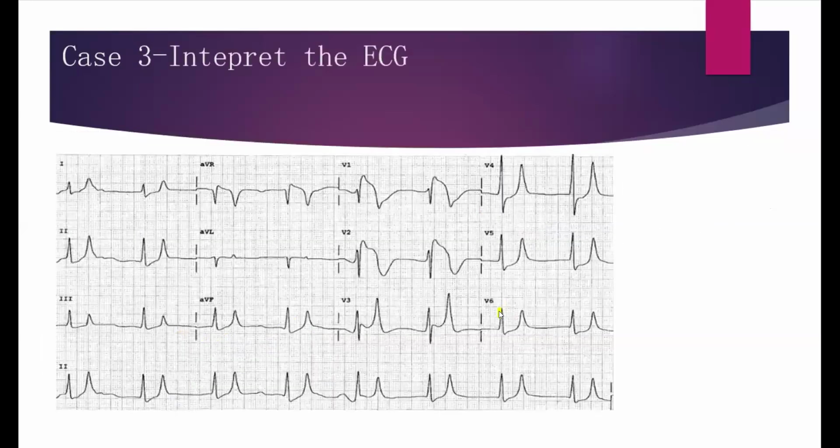And then finally, the other conditions. So you can have hyperkalemia that may mimic ST elevation. This is not your usual ST elevation. It's called a Brugada-like type ST elevation. So hyperkalemia can occur and mimic these things, especially in V1 and V2, which already have some level of elevation even in normal individuals, especially in men.